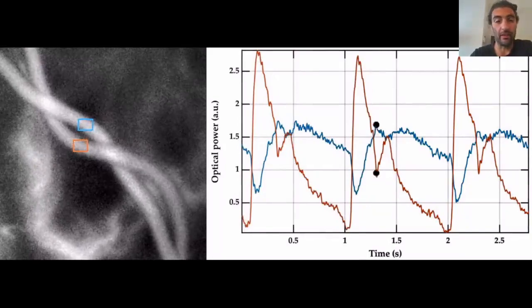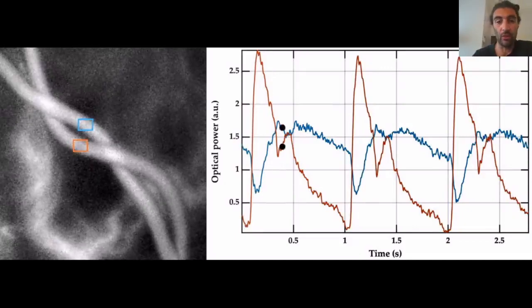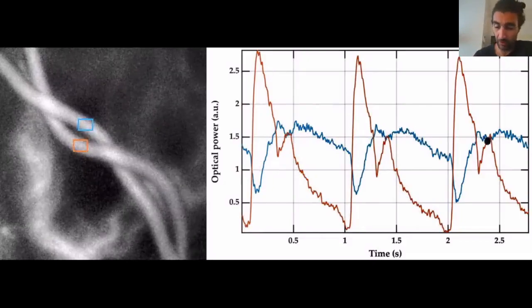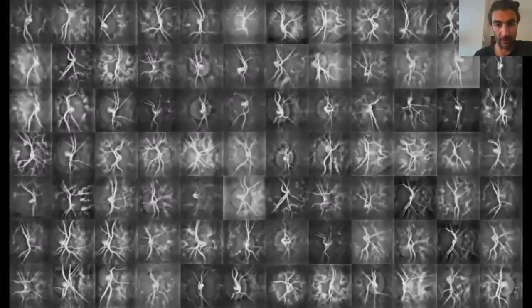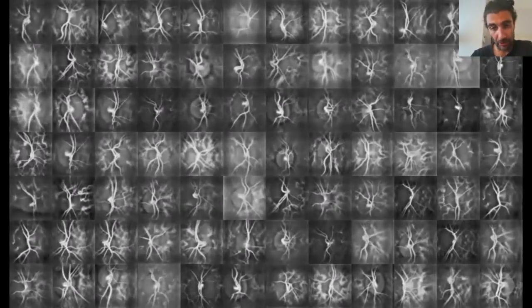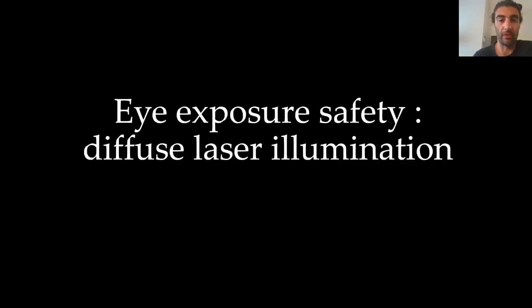And those images, then, power Doppler, will reveal something very interesting for ophthalmologists, which is the pulse wave in the retinal arteries and some signal in the retinal veins as well. And what is very important is that we can do that in pretty much all the patients that we've been able to image, in the neighborhood of the optic nerve head. The images that you see are about 2 to 3 millimeters, okay, in field of view.